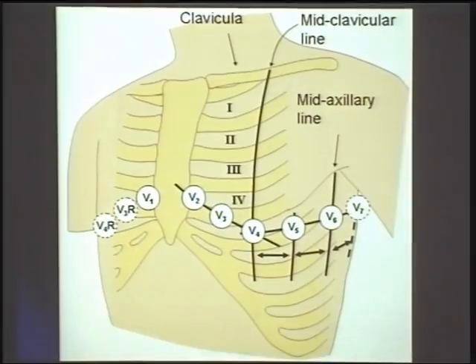That is the purpose of your lead system. So you can see that in some special situations, like in pediatrics or in patients with an inferior wall infarction, to diagnose a right ventricular infarction, you have to place the right-sided leads, or when you are suspecting dextrocardia. In all these situations, you have to take the right-sided leads. Pediatrics, inferior wall infarction, right ventricular infarction and dextrocardia. In these situations you have to place the leads in the same area on the right side, as V3R and V4R.